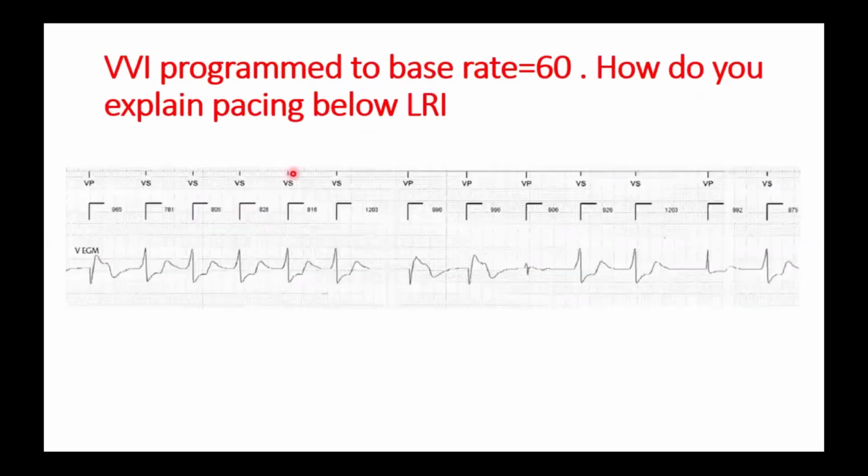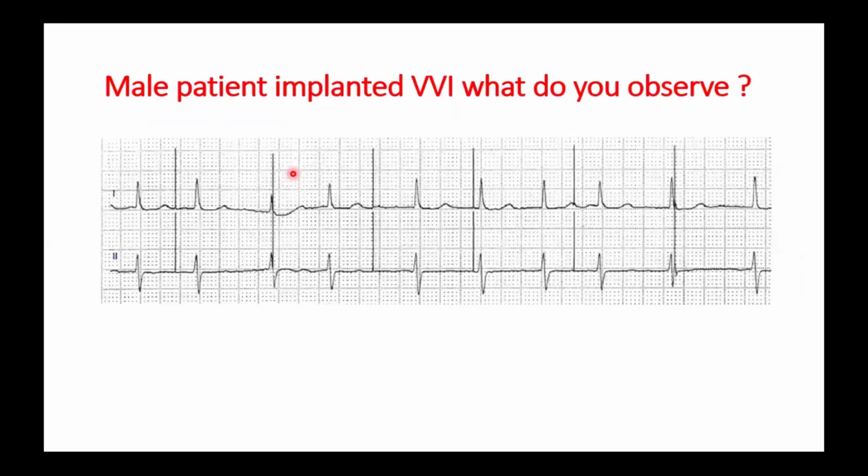Okay, Dr. Rossasy, you are going to give some examples and then we'll ask the audience to answer, yes? Okay, no problem. From the next case, I can give the slide to anyone who would like to share it, because I can see them answering in the chat group. Dr. Amr answered correctly. Let's give them just a second to think, and then we will give the answer.